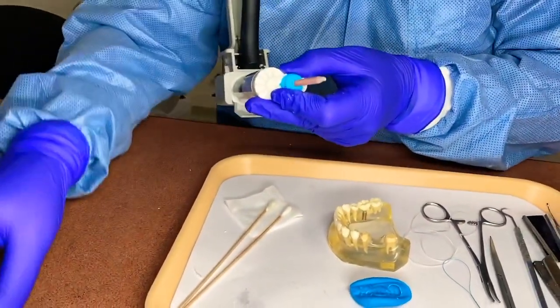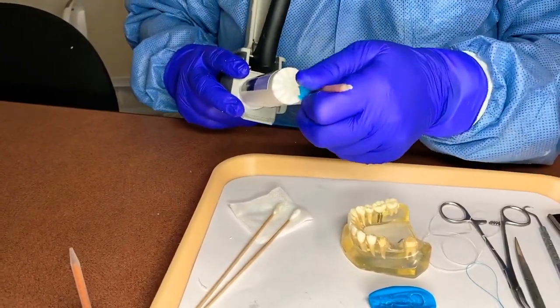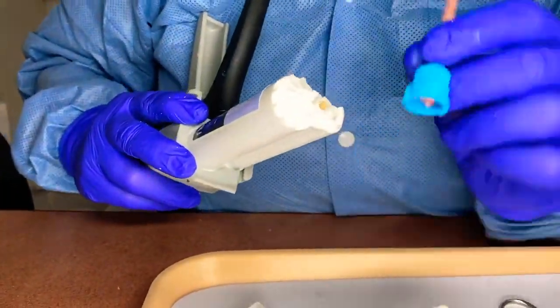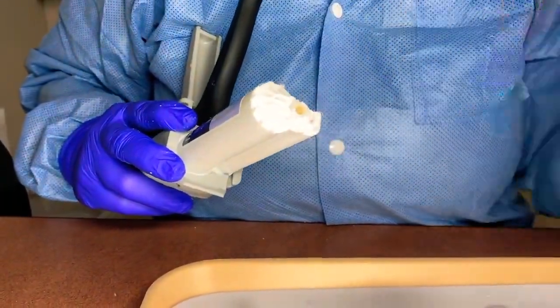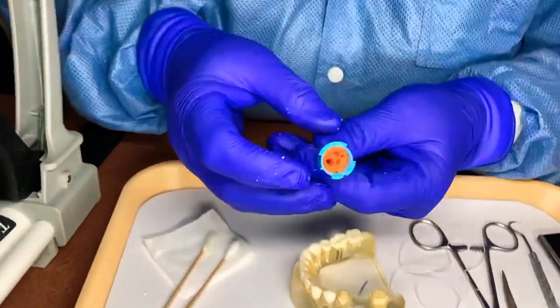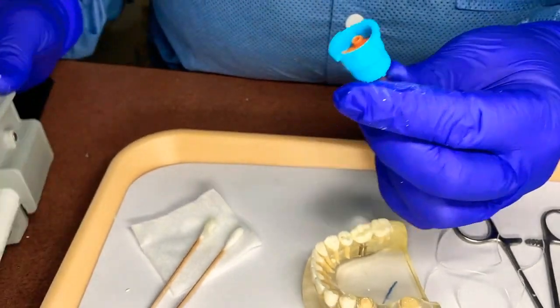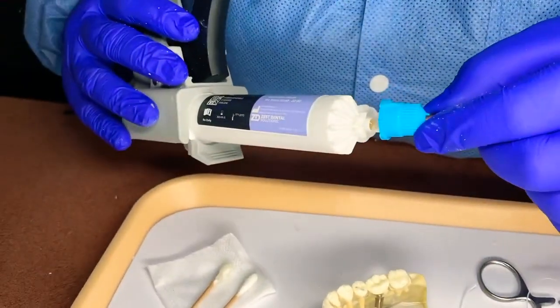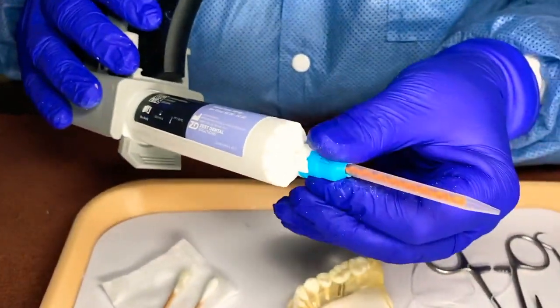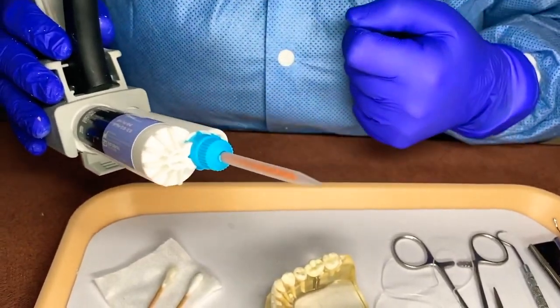The tip is left on so the base does not get dry and the material doesn't get wasted. You're going to take this off by matching the little triangle with the little triangle here. Same with the new tip — it has a little point, and those little circles line up. Then you just turn it towards you or the opposite way to lock it in.